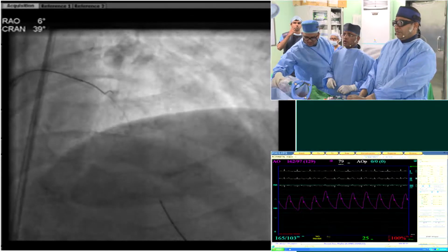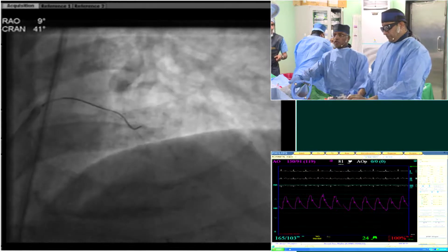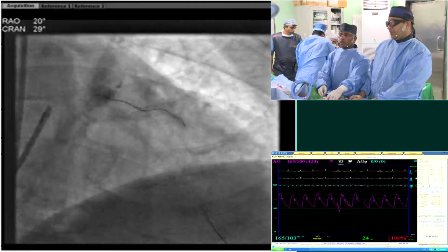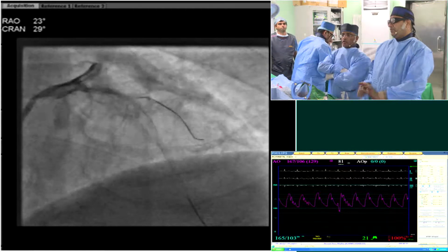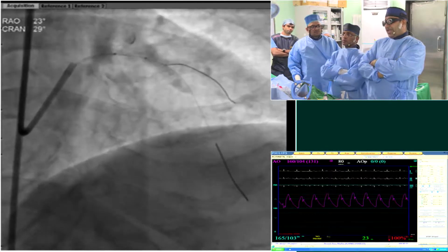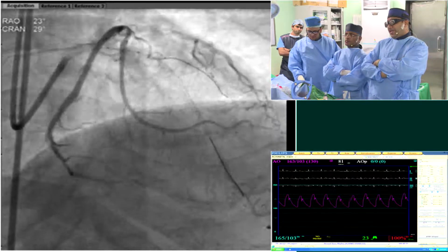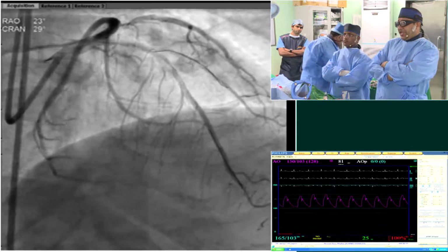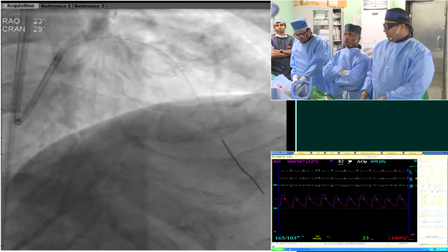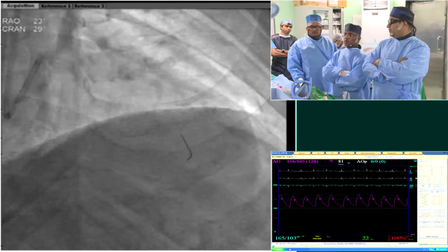Then we decided to directly take the balloon and dilate the lesion. We tried to use an OCT catheter, but that also could not pass across the tight lesion, and it required pre-dilatation with a 2.5 mm balloon. Multiple dilatations were done. This is the status of the artery. Finally, we had a tortuous diagonal and a calcified LAD-diagonal bifurcation. We finally got a Pilot 150 across, but the distal end doesn't seem to be in the true lumen, and there was no way I could cross anything else. So we decided to pull the wire out and rotate the LAD, because the OCT catheter also couldn't go through despite the pre-dilatation. We'll show you the rotational atherectomy we have done to the LAD.